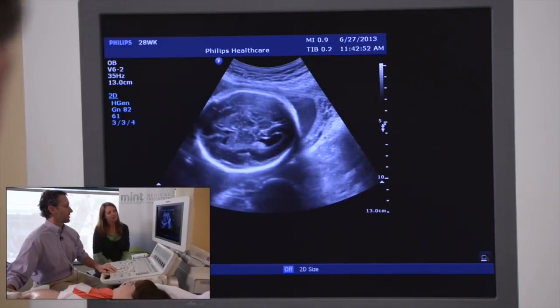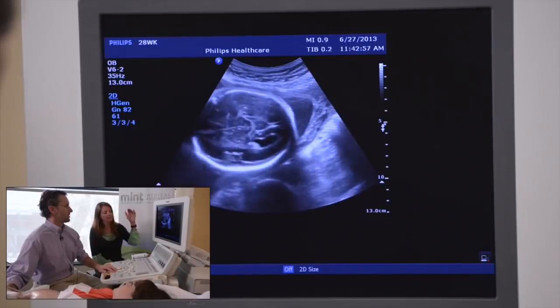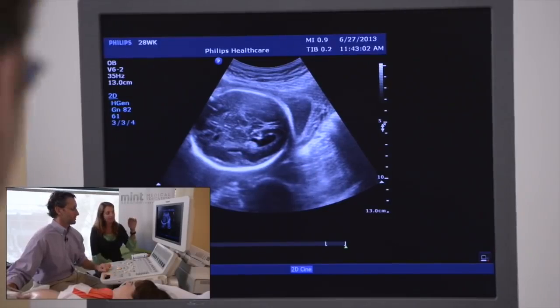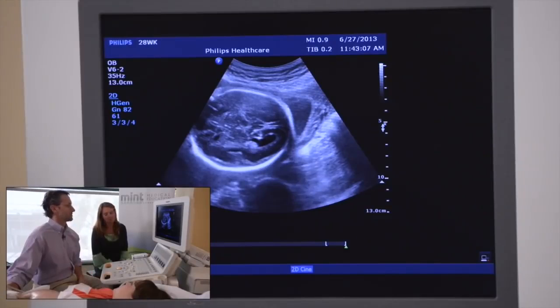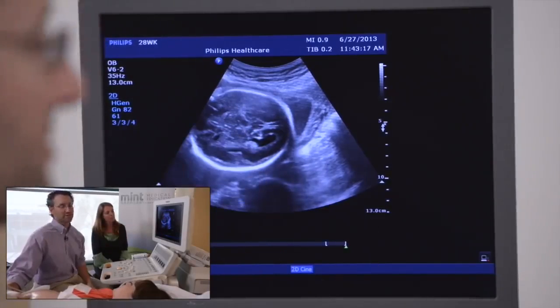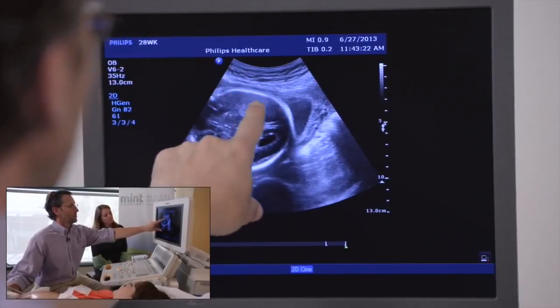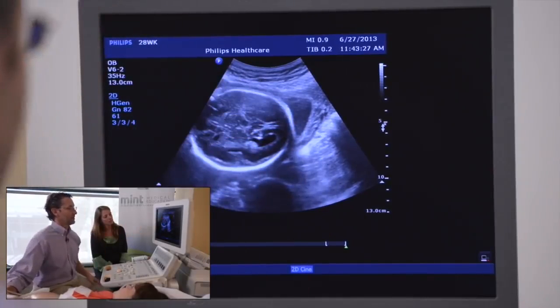That downside anatomy of the brain is always a little bit easier to see than the anterior superficial side, just due to the proximity of the skull. So you get that anterior artifact of the reverberation. If you notice here, we see this ventricle perfectly. However, up here there's another ventricle sitting right there, and you see nothing. That is what Michelle referred to as reverberation artifact coming off the skull. So it basically makes everything up there invisible.